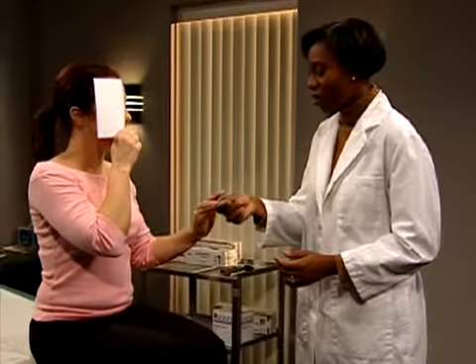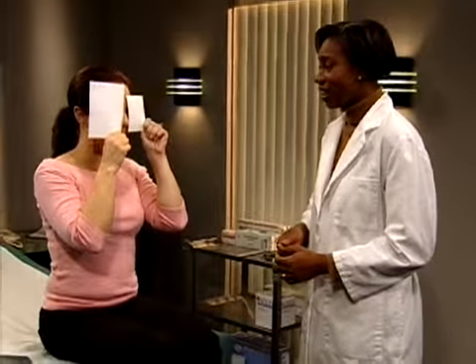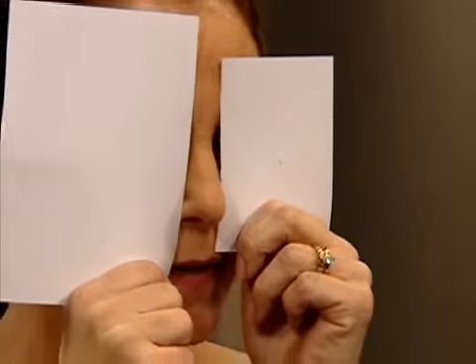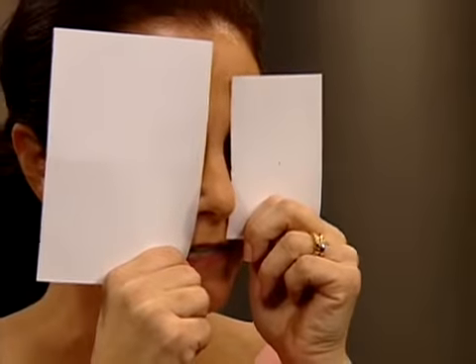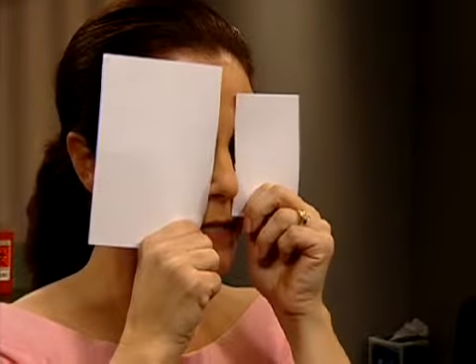Now cover your right eye with the card. Left eye. If the patient's distance vision is less than 20/20, have her hold a card with a small pinhole over the uncovered eye and read the chart again. If visual acuity was reduced by a refractive error, this should improve acuity by at least one line. TEC.